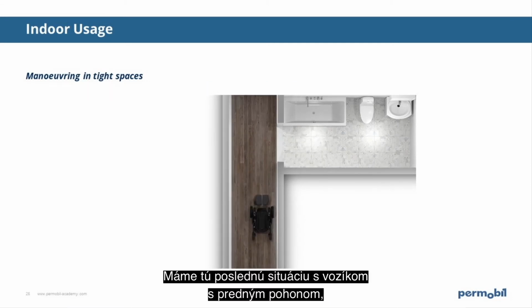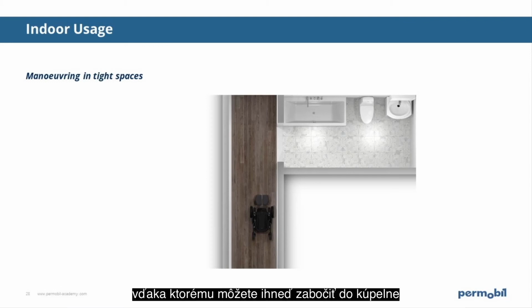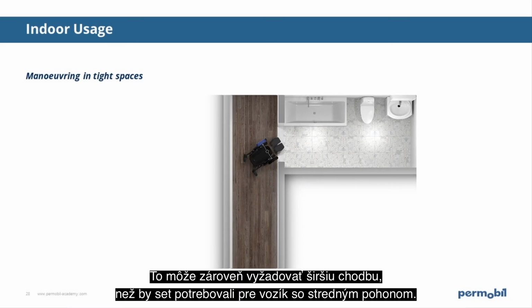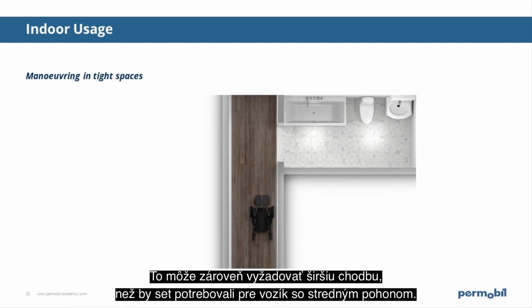The last situation is with the front-wheel driven platform. With this platform, you can quite rapidly make the turn into the bathroom. But please notice that the rear end can swing out, so this can also require a slightly larger hallway than you need with a mid-wheel driven platform.